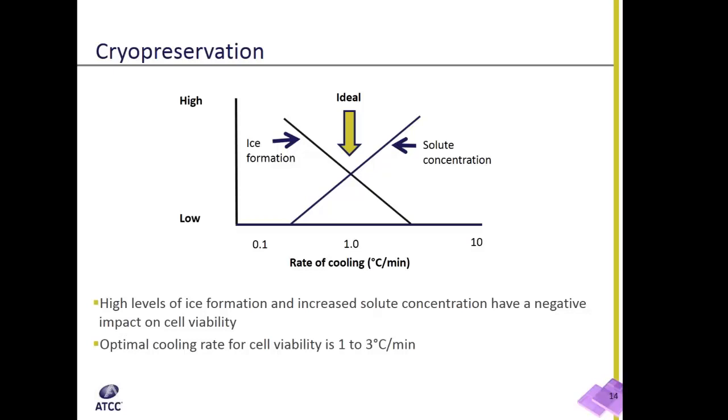The biggest factor that determines the occurrence of cell damage and how this damage can be mitigated is the rate of cooling. When cells are frozen rapidly, water and ions tend to remain in the cell. This will minimize solute concentration effects, i.e. osmotic imbalance, and reduce dehydration. However, intracellular ice formation is maximized, causing intracellular damage through mechanical action of tearing and piercing the cells.